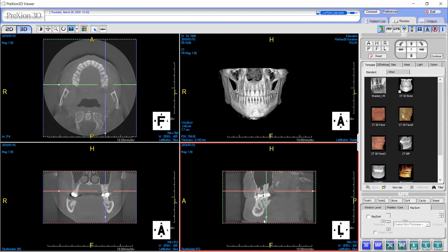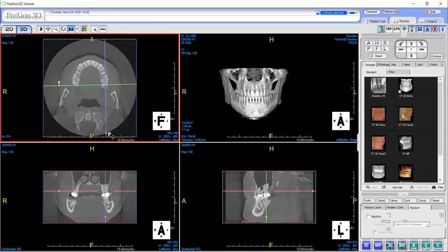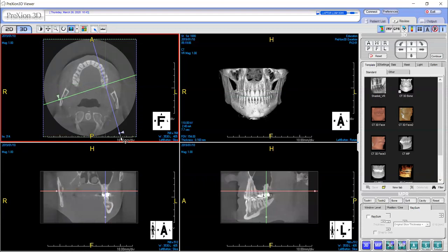In this case we are working on the left side, and you may want to swivel your sagittal axis to make it parallel to that side of the arch. To do so, I'm going to pick up my anchor point located at the bottom of the blue line in my axial plane, pick it up and swivel it over to make it parallel to the left side of the arch. When I do that, you'll notice that on my sagittal view I can now see along the arch, which gives me a better view.